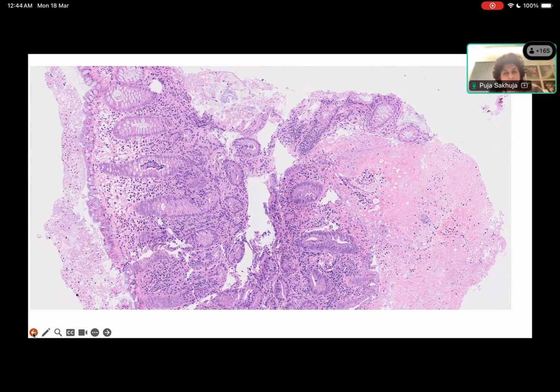Okay, let's now go on with this case. The clinical suspicion here, because the patient was passing stools with blood multiple times, was of IBD, UC or Crohn's disease. Can IBD occur at this age, 4 years? Yes, ma'am. Pediatric IBD is a well-known entity, so that is a fair enough clinical suspicion.